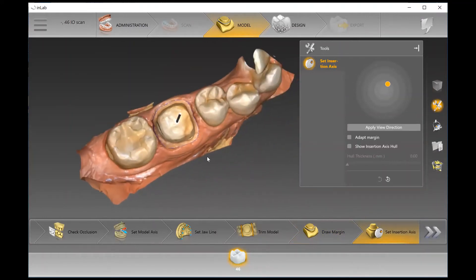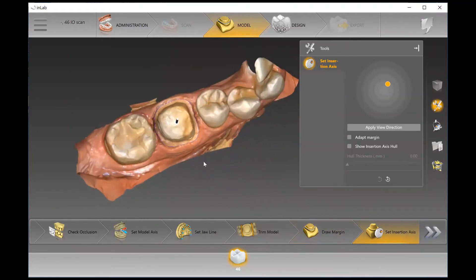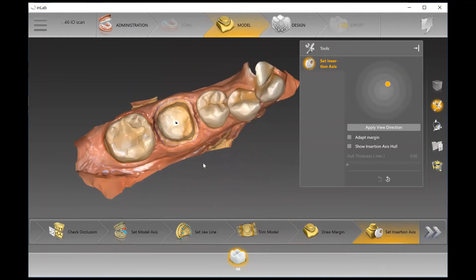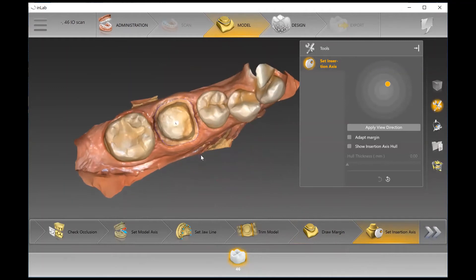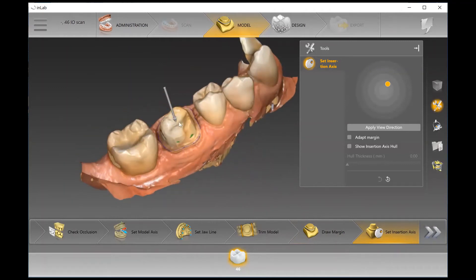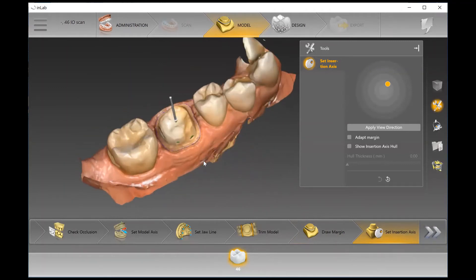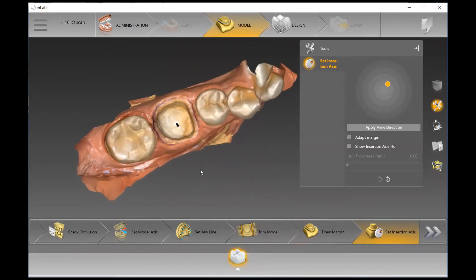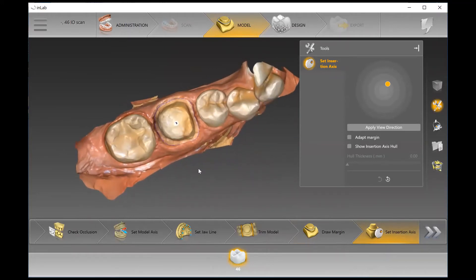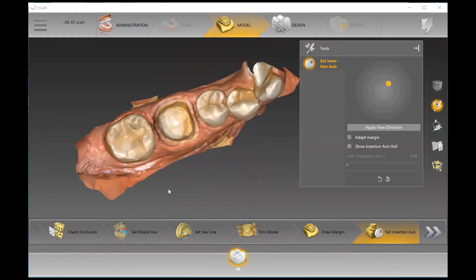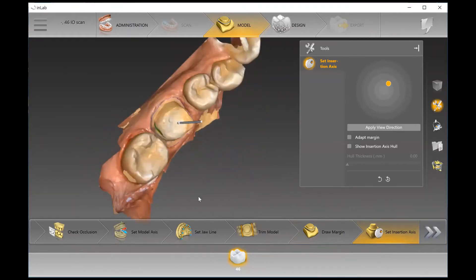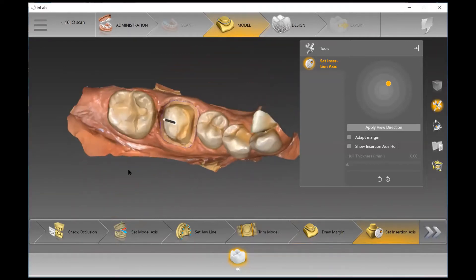The next step is Set Insertion Axis, where we tell the software exactly how this restoration is going to be inserted post-manufacturing. You can either use the arrow on top, but what I like to do is maneuver my model so I'm looking straight down the path of insertion, then hit Apply View Direction on the right-hand side, which adjusts the arrow accordingly and helps minimize undercuts.